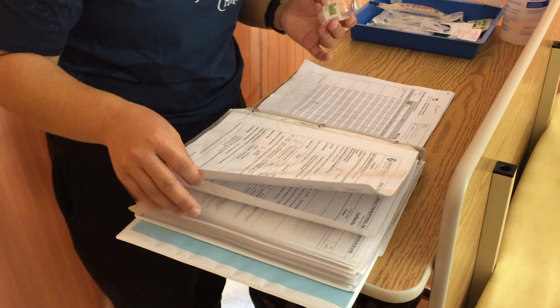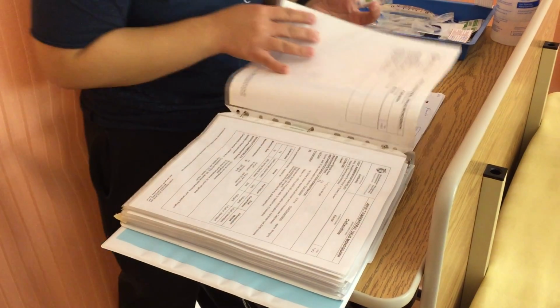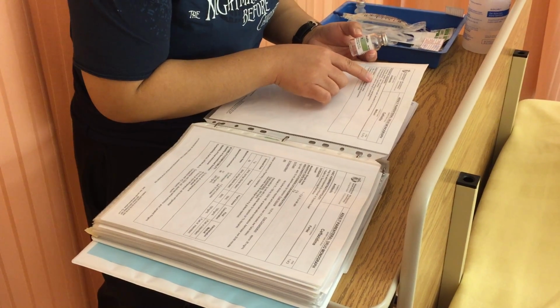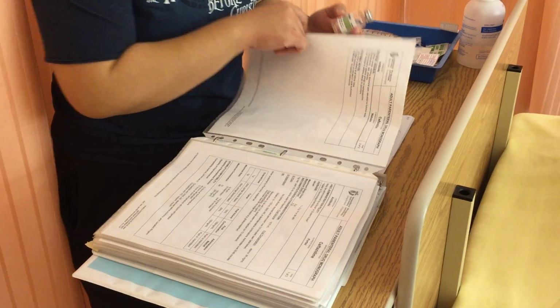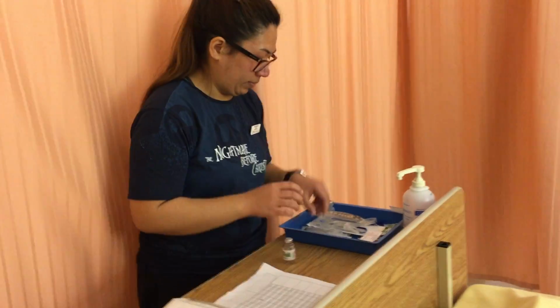And I would just have to check the compatibility very quickly and the potential hazards of this medication, contraindications, and if there's any additional notes. All right, now I would have to get my other stuffs ready.